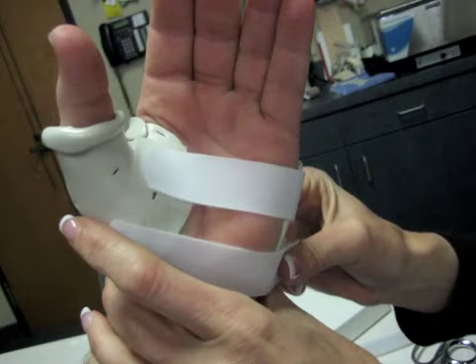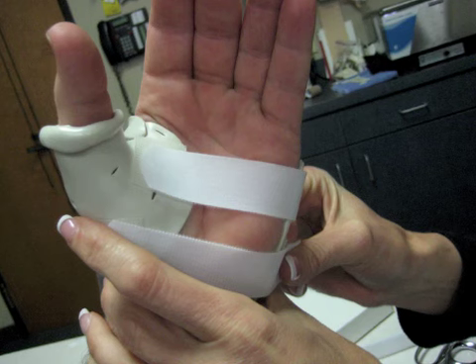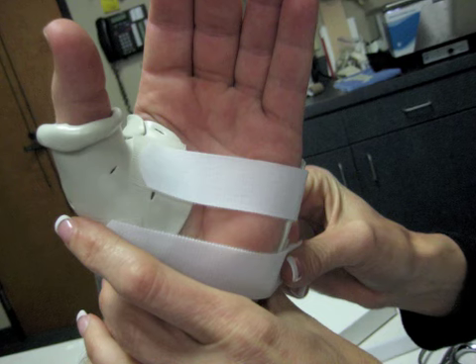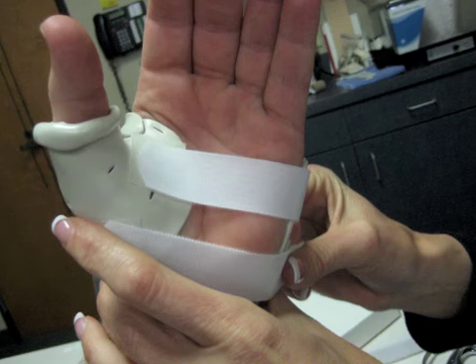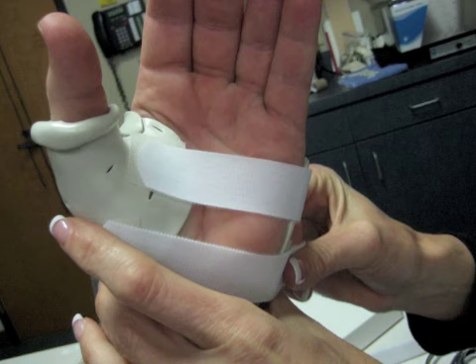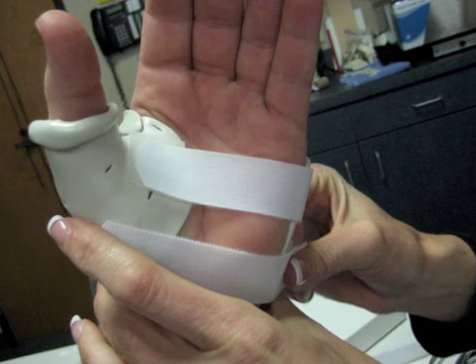With every splint that you make, there are many important considerations: Will the client be able to perform ADLs? What are their leisure activities? Do client factors such as decreased sensation prevent the client from noticing irritation or skin breakdown? Does the client possess the process skills to correctly put on the splint? As an occupational therapist, it is important to always make sure that your intervention, even splinting, is occupation-based and client-centered.